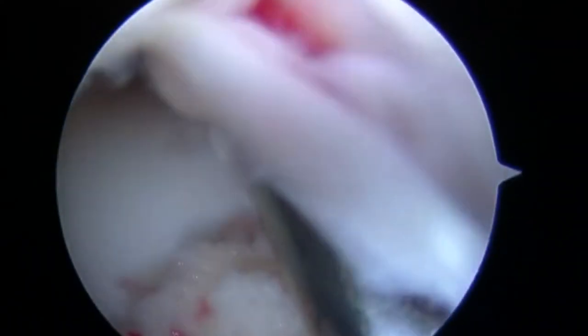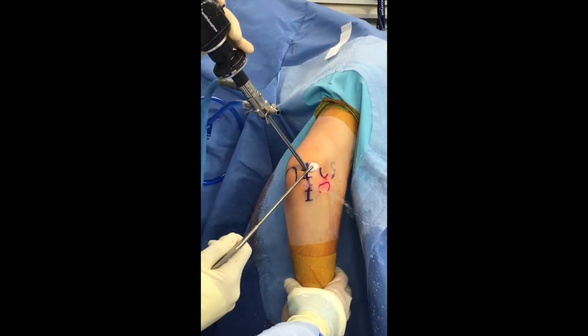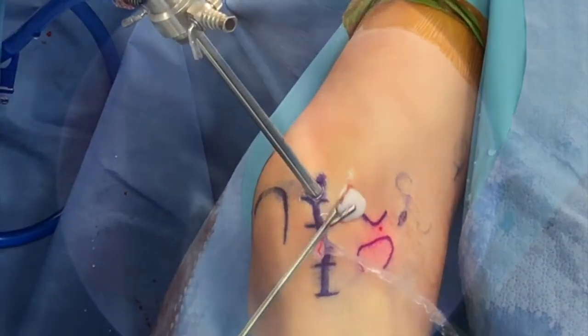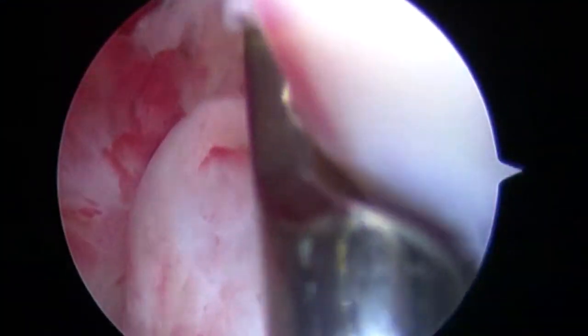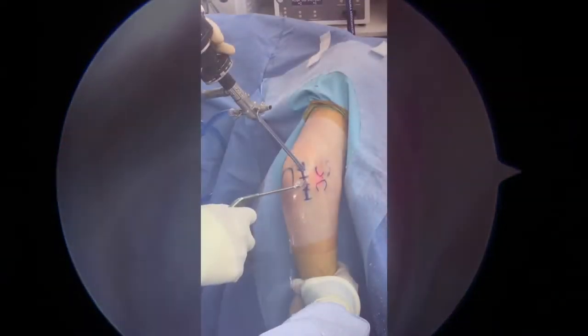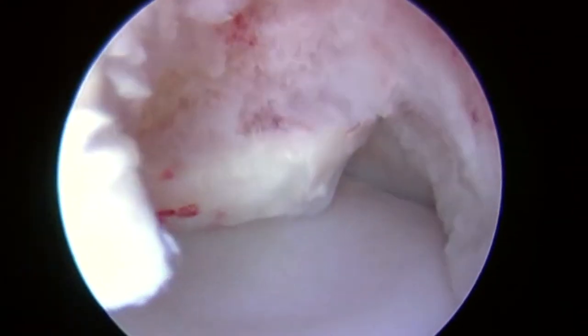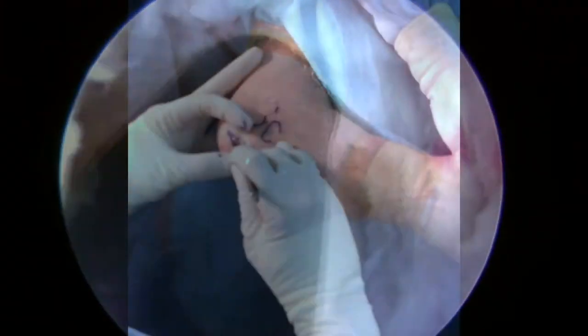Grasping instruments are used to remove the osteochondral fragment, and we can appreciate the size of the lesion. Further osteochondral fragments are removed. After further soft tissue debridement, the lesion is inspected and seen to be fairly lateral and poorly contained.